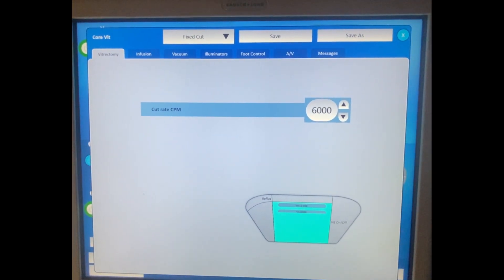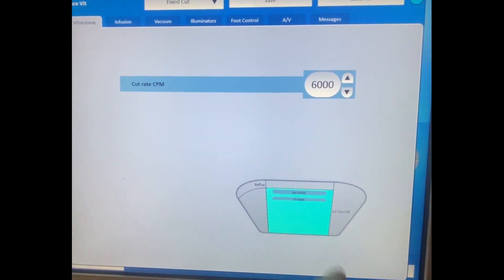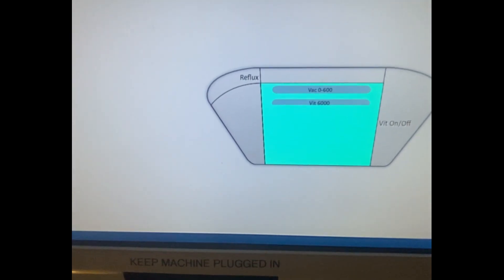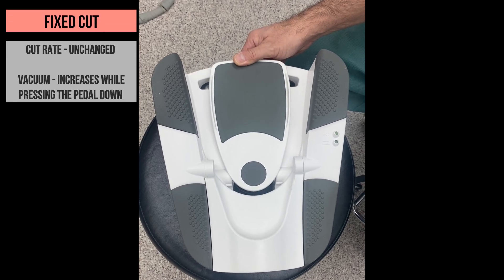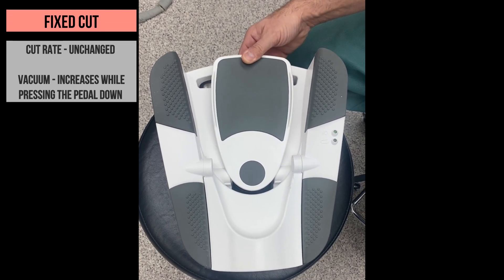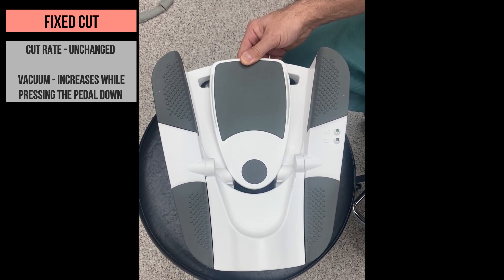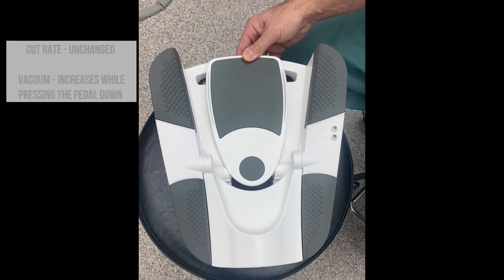In fixed cut sub-mode, the cut rate doesn't change. We just have a linear vacuum and cut on or off — clicking to the right and clicking to the left. The vacuum gradually increases while pressing the pedal down to the floor, while the cut rate stays the same. Then the right side click turns off the cutting and leaves only the vacuum. One more side click turns on the cutting back.